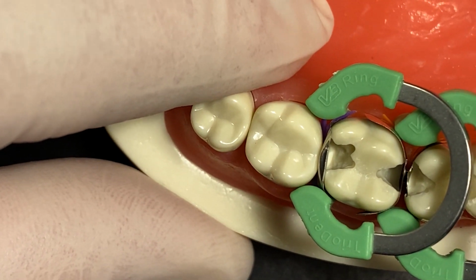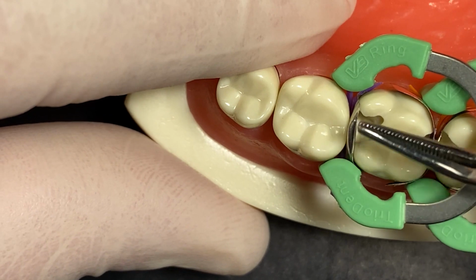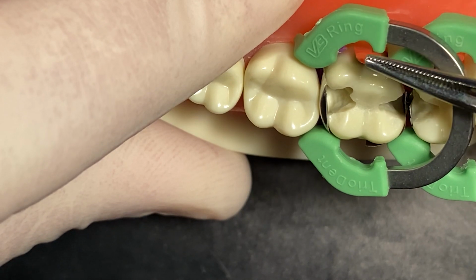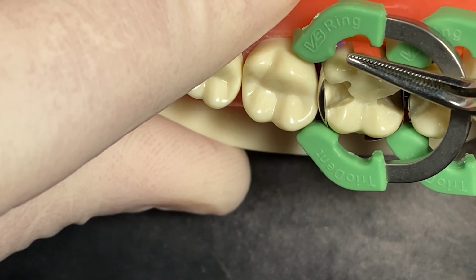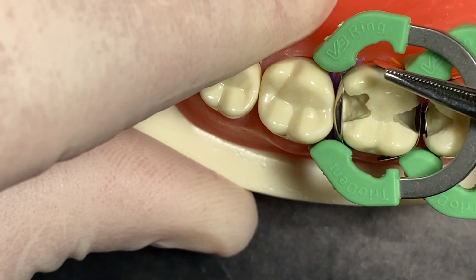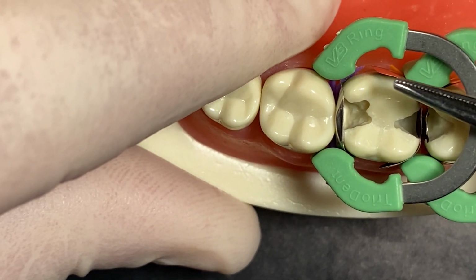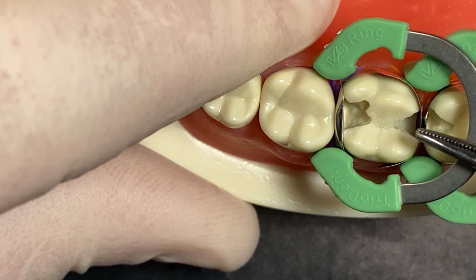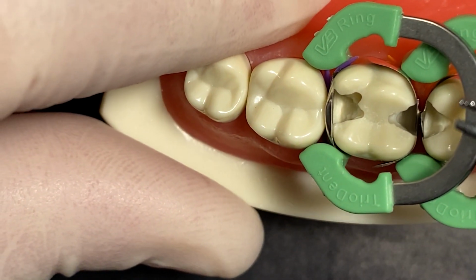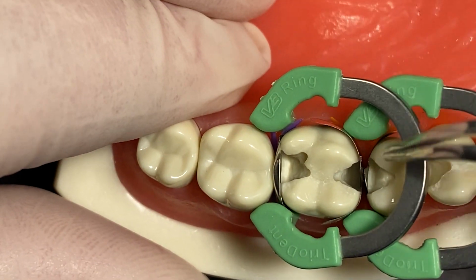But you can see, just by taking one of the matrix bands away in this case, or like a free sectional, it really frees up your workspace here, especially as the rings start to wrap these sectionals around the teeth. You're greater than halfway around that tooth, and this is a molar. So if you had another full sectional here, these would be interfering and not allowing them to sit properly, which can ultimately impact how the whole sectional sits in this area and cause issues with your contours and your contacts. But you can see this is a stacked system.